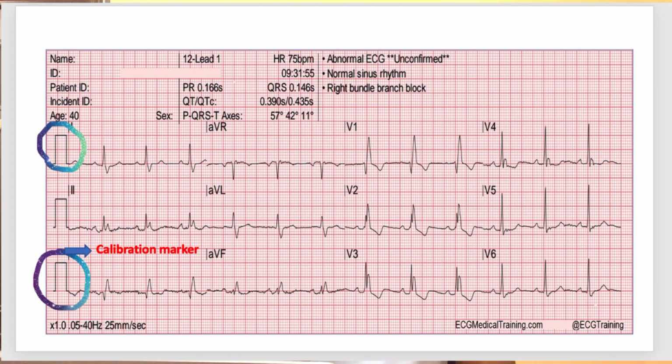And it is no strange thing, but just this rectangle that is shown here in this image at the far left, preceding these leads. And we notice that this rectangle has two large squares on the vertical axis, that is 10 millimeters.